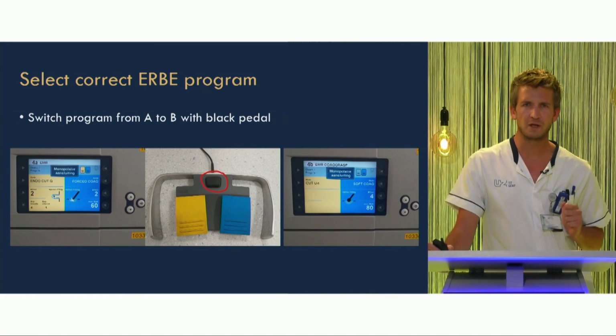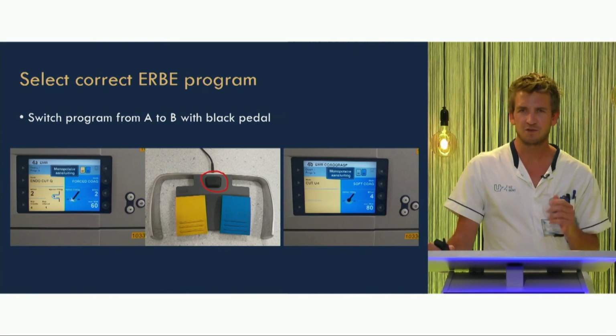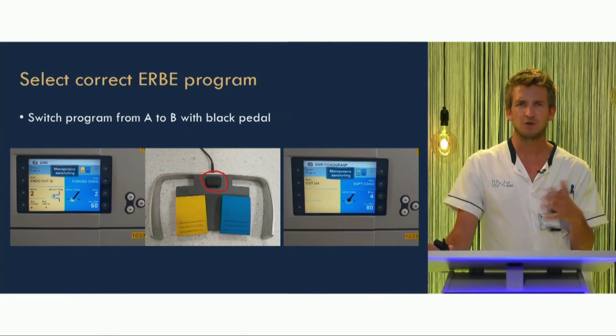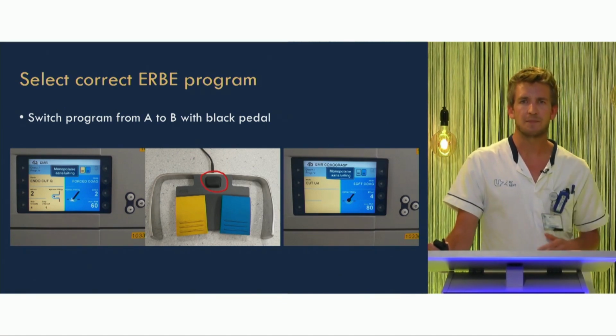Most of you will probably know you can switch easily from program A to B on the VIO from Erbe with the black pedal. When you don't know it, it's very useful. You can easily go from one program to another. Most of the time we use the soft coagulation for program B. So when we have a bleeding, we can easily go to the soft coagulation just by tapping the black pedal.